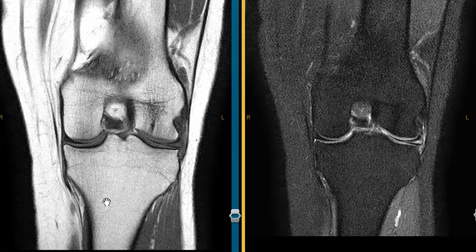Hello, this is Dr. Gay from First Sick MRI, and this is a 30-year-old male with complaints of knee pain for about 3 weeks. He's a runner, and on this view we can see that there is a difference between the medial meniscus, this little black wedge. It's a shock absorber between the femur and tibia here.